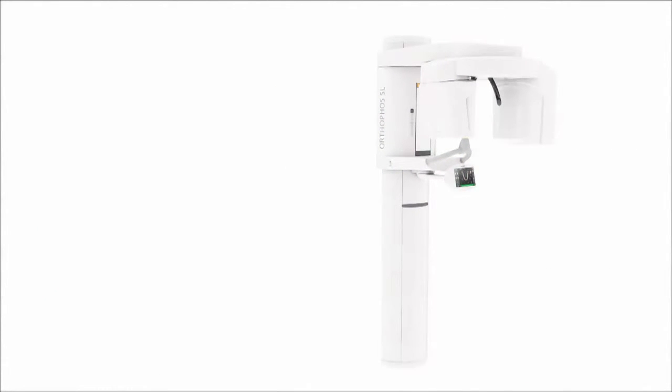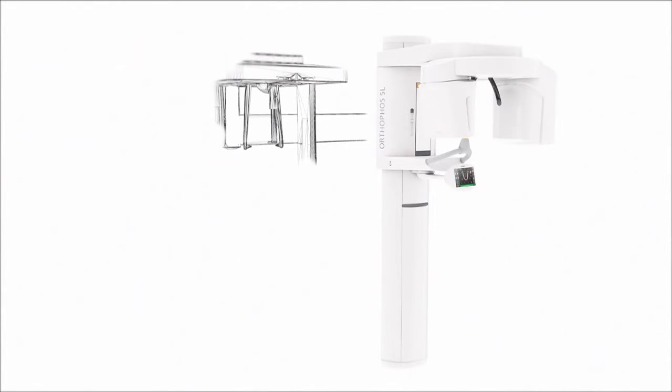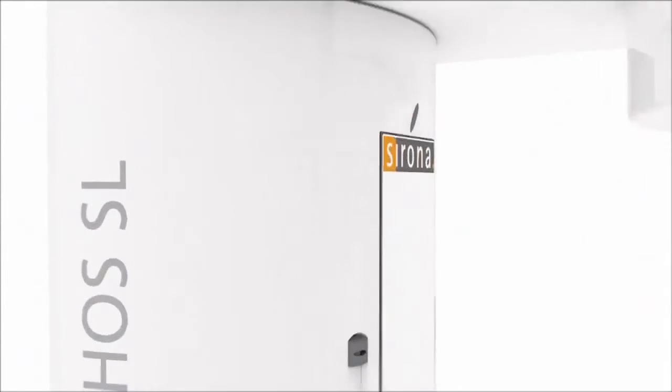You decide how to integrate Orthophos SL into your practice and augment it with upgrades.